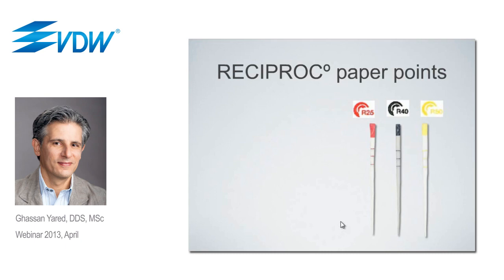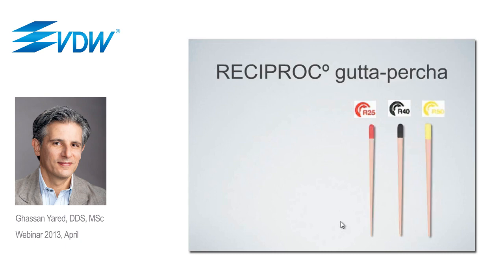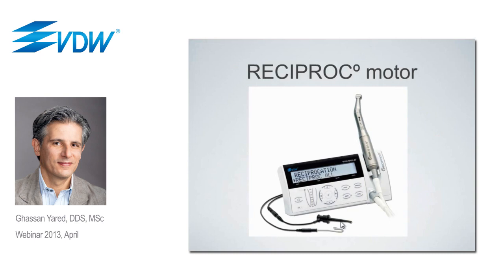Also in the Reciproc system, there are matching paper points, and there are matching gutta-percha cones. And there will be, in the future, shortly, matching obturators like the GuttaCore or Thermafil, but for the Reciproc system. This is the Reciproc motor. The Reciproc motor can also be used, if you want, for clockwise rotation.